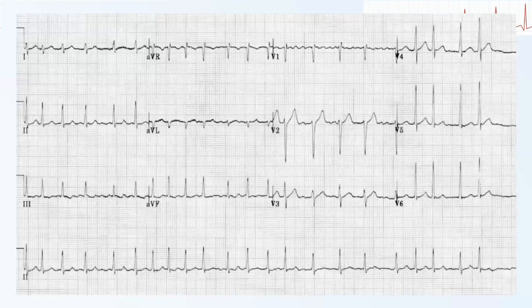This is just another ECG of atrial fibrillation. Again, it's irregular. It's got a bit of a faster rate at about 126 beats per minute.